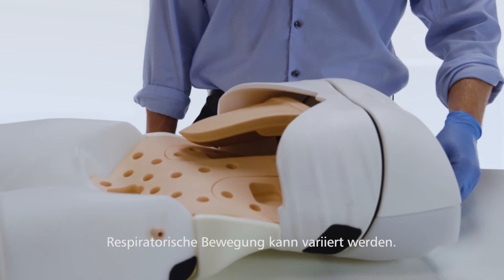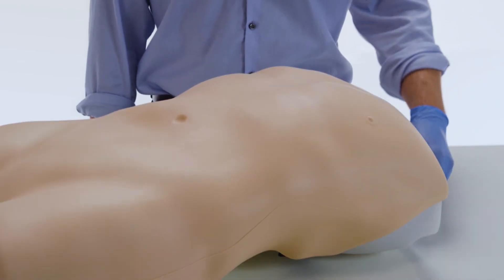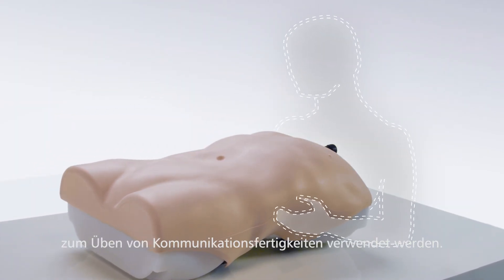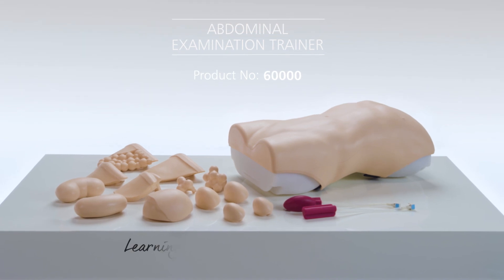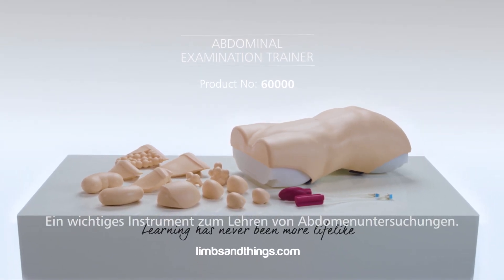Respiratory movement of the liver and spleen can be varied using the breathing mechanism. Used in conjunction with a simulated patient, communication skills can be practised. The abdominal examination trainer from Limbs and Things is a key tool in teaching the fundamental skills of abdominal examination.